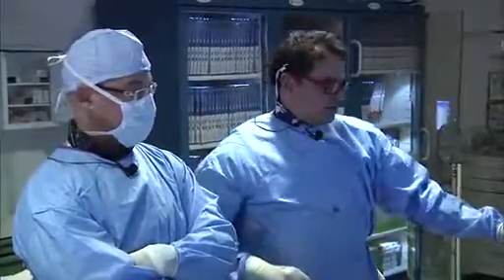We did it safely. We did it on the angiomax. You know, she had pain while we did the actual balloon angioplasty that gave us a sign. She's having a little bit of tenderness in the groin, and I think here we're 10 minutes under our hour, which is great. And I think it was a nice demonstration of a pretty complex lesion with heavy calcification, taking into consideration the vert and the LIMA.